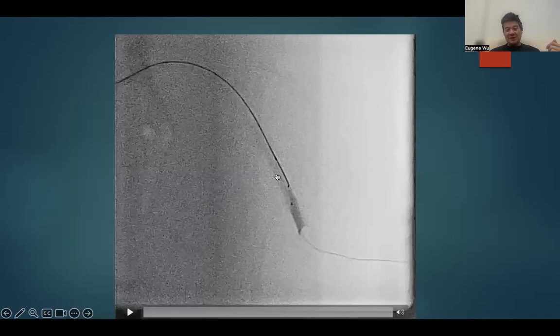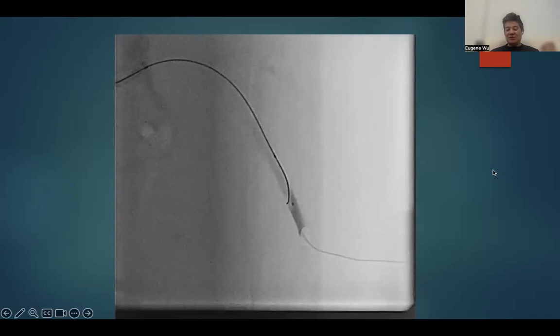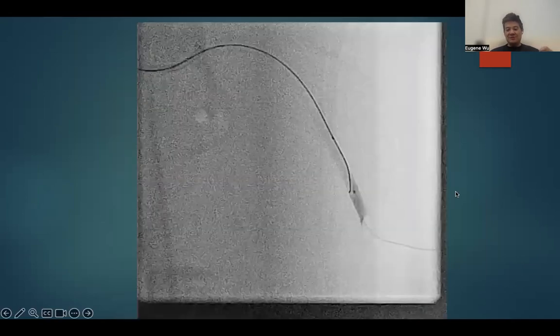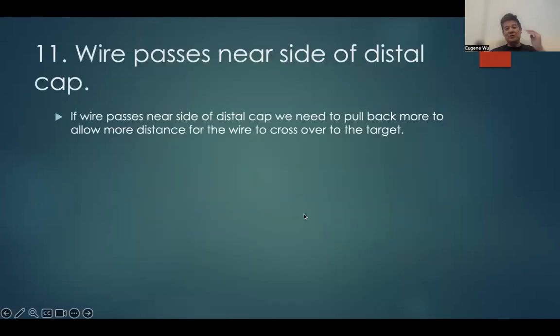This is the wire, okay, on a fine cross in the antegrade. And you will see when we push this wire, it misses by going beyond the distal true lumen marked by the fine cross. Here we push, and it's gone beyond, okay? So the correction for this is to rotate backwards, okay? So here, you come back a little bit, and you rotate 180 degrees, and you can poke into the true lumen, okay? So this is the method to deal with going beyond, step 10.